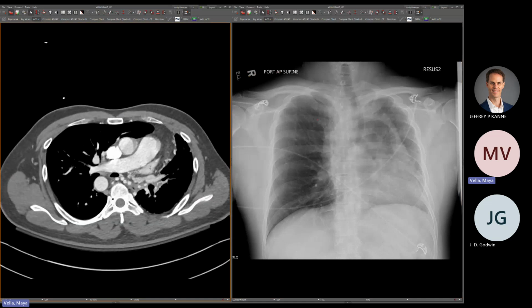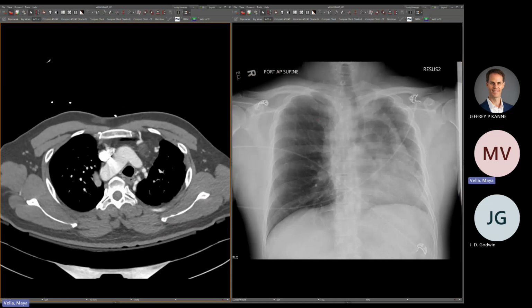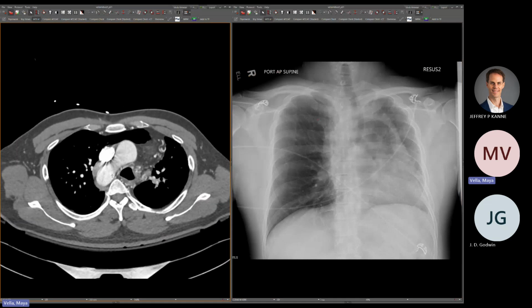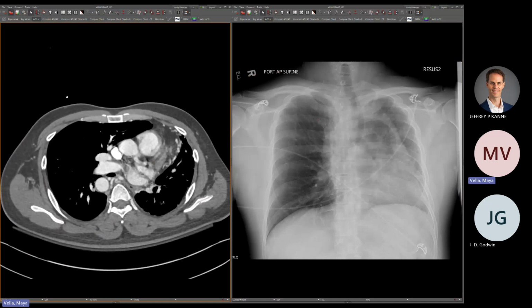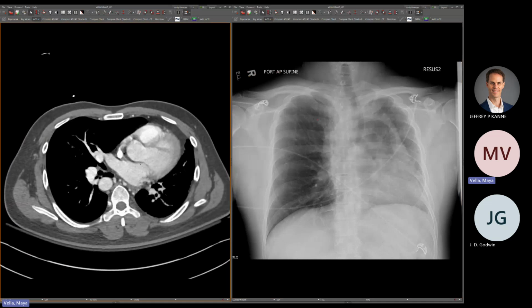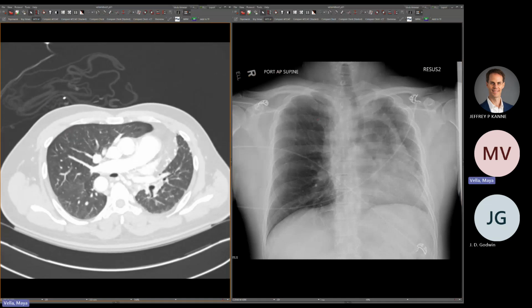So unilateral absence of the pulmonary artery. And we see all of these big tortuous bronchial arteries coming off the aorta and going to the left lung, supplying that small left lung. We have sort of associated hypertrophy of the right lung, which is pooching over midline, and it's what's causing that weird appearance of this lucency here overlying the mediastinum.